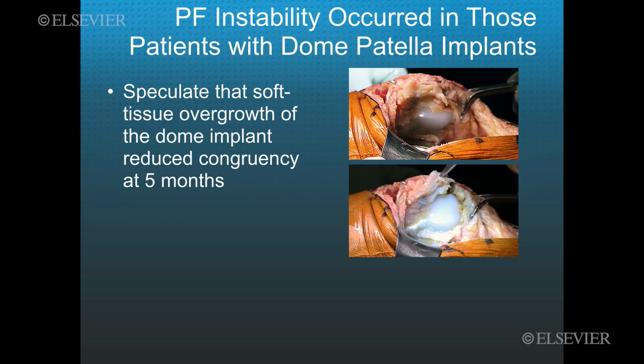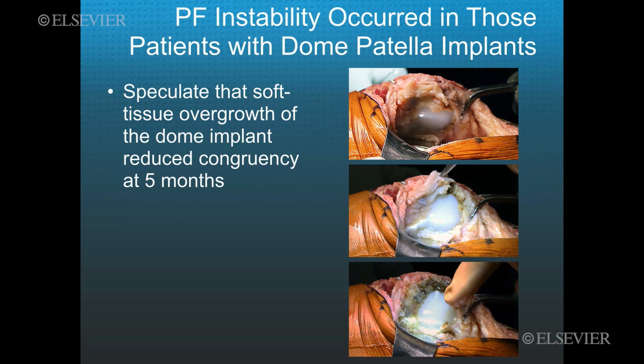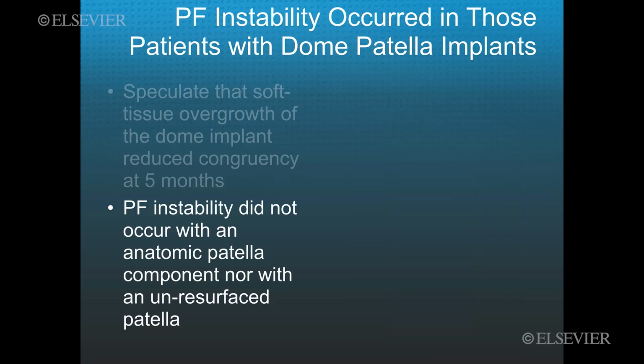We can lift up a little piece of it so you can see how it reduces the convexity, and then you can see once the soft tissue is removed, the convexity is fairly well restored.